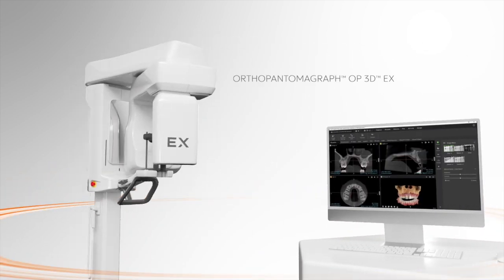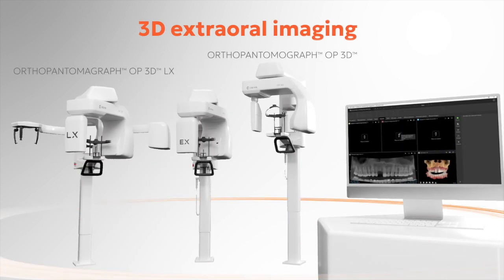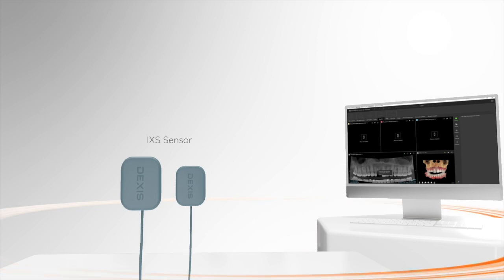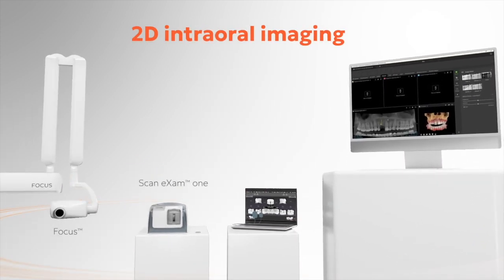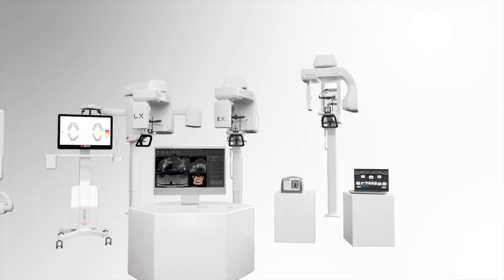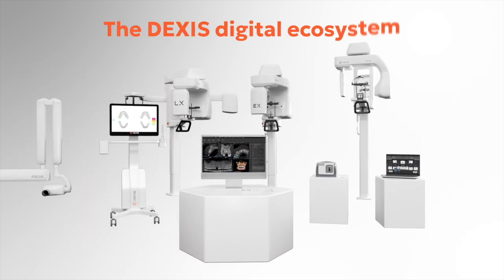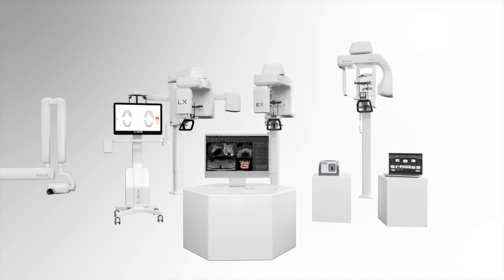The DEXIS digital ecosystem empowers you to streamline your workflows and revolutionize patient care like never before. Your journey towards streamlined workflows and improved patient outcomes begins now. Discover the future of dental care with DEXIS digital ecosystem. Embrace technology and contact us today.